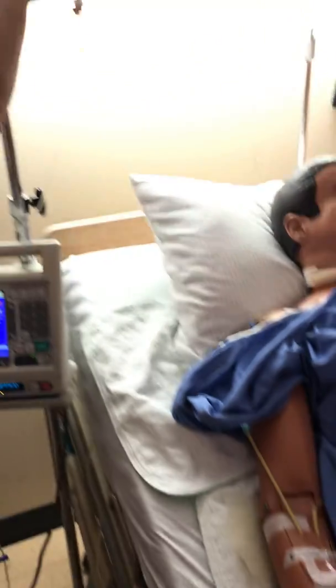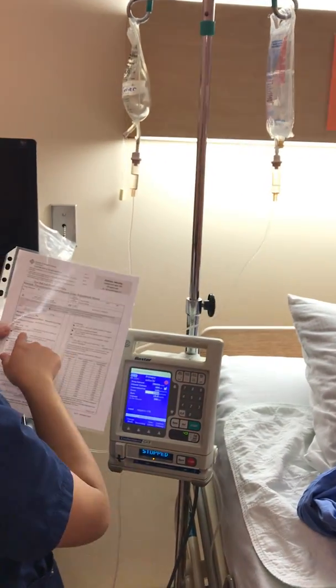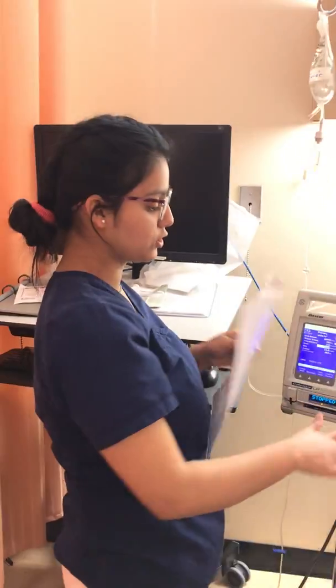We have the right patient, Ms. Wendy. We have the right drug, heparin. Right dose, 25,000 units. The right rate is 1350, and the right time is now, and the right route is through continuous infusion.